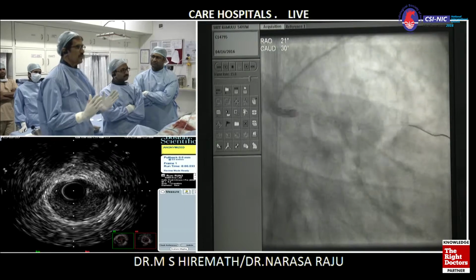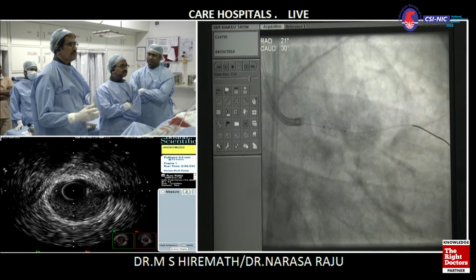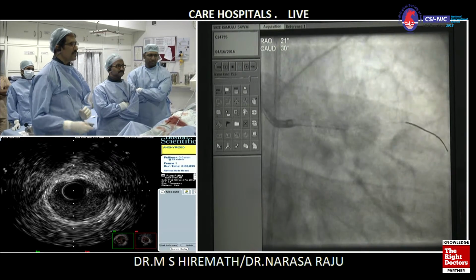We said we'll balloon dilate the stent. So this stent has the ability to be stretched. This was a 4.0. The Ultimaster could be stretched to 5.3. This was a 4 into 8 length NC balloon. This is an Abbott balloon, NC Trek. The distal part of the stent was dilated to about 10, 12. Proximal, we went to 26, 28. And we will now show you the images, angio.